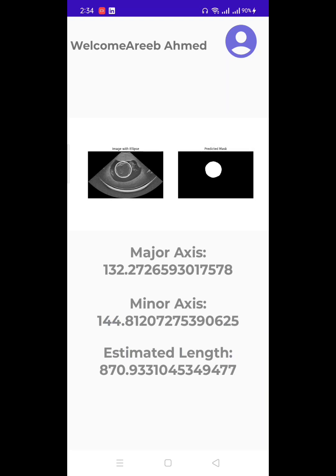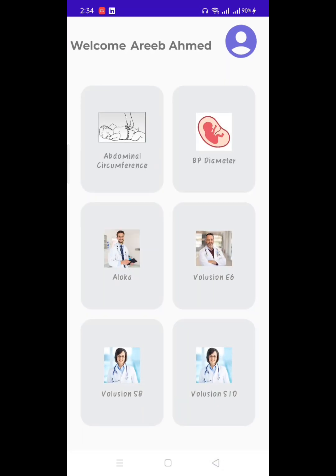As you can see, it makes an ellipse on the abdominal, as it highlighted the abdominal part of the image, and then it predicts its mask, and here it shows me the major axis and estimated length of that abdominal. From there we can predict the abdominal behavior of that baby. So here it is, and then we can do it for more parameters.